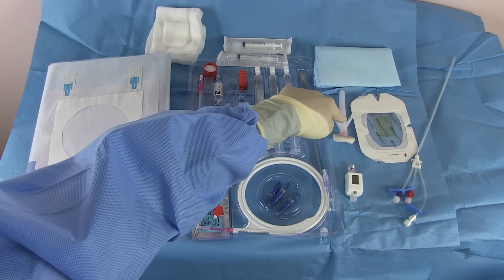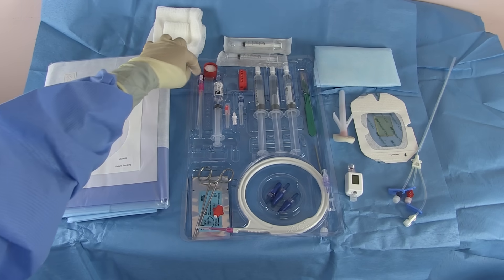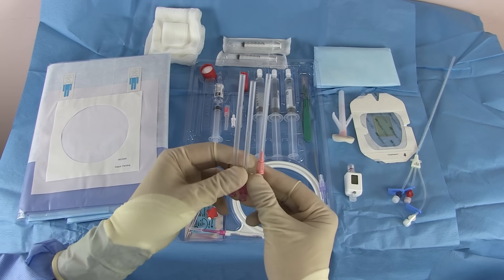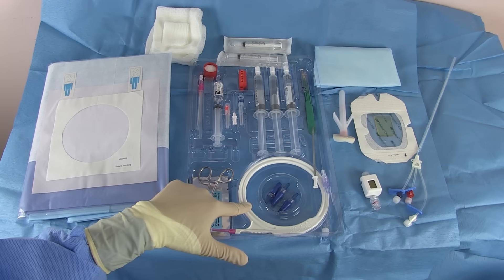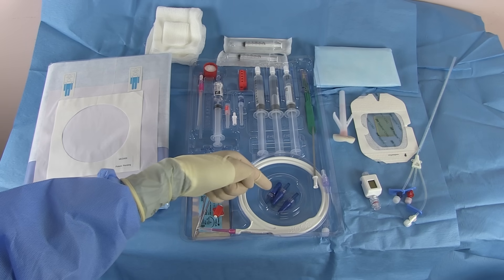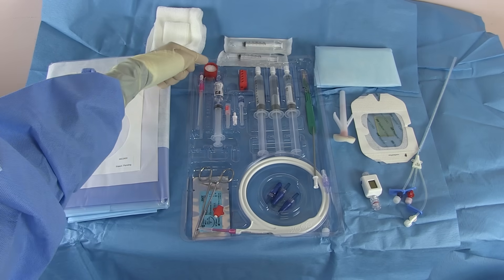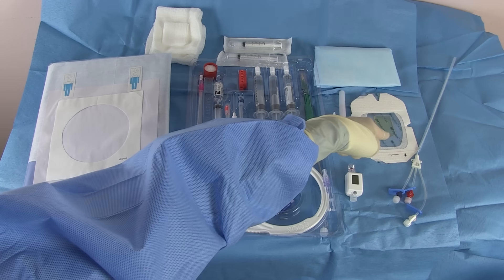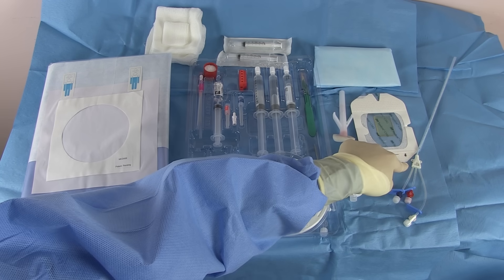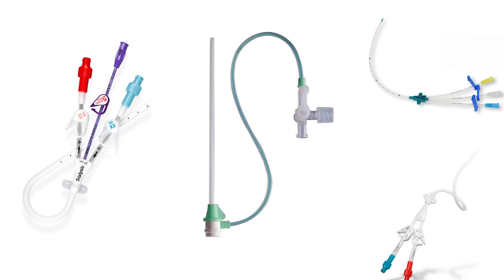There's the drape, the prep stick, the lidocaine syringes and needles we need to inject. Here are a few finder needles — one is long, one is short, and one has a small catheter attached to it. Here's the guide wire in its sheath, the dilator for the skin, the knife, sterile saline flushes, caps for the catheter, suture, needle driver, and catheter fastener. Some places to hold sharps, sterile dressing and probe cover, and the catheter itself. We're using a triple lumen here.